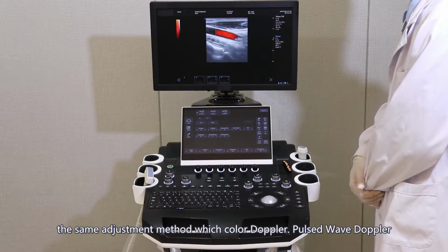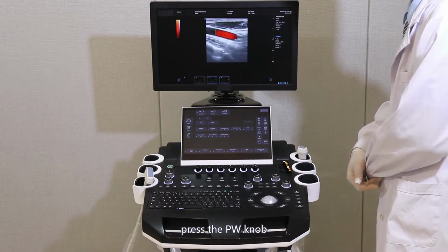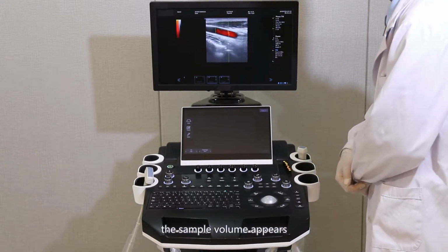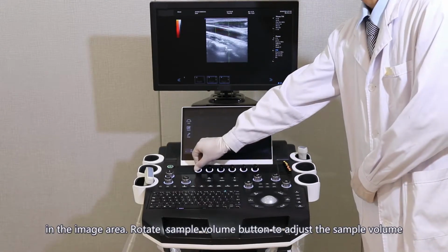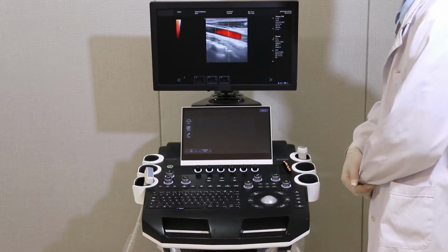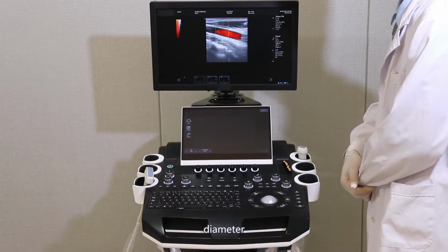Pulse wave Doppler. When examining the blood flow spectrum, press the PW knob to enter the pulse wave Doppler state. At this moment, the sample volume appears in the image area. Rotate the sample volume button to adjust the sample volume. Generally, the size is about 1/3 of the blood vessel diameter.